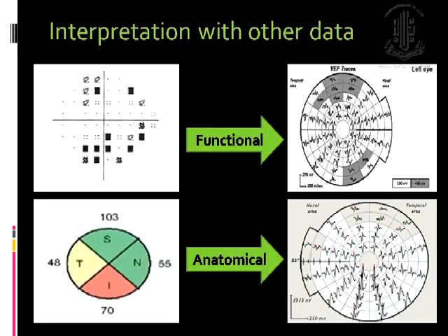Even anatomically, when you check the OCT, you can see that the OCT also can give you some clue about specific sectoral loss, and you can confirm that with the multifocal VEP, and you'll find it's matching.